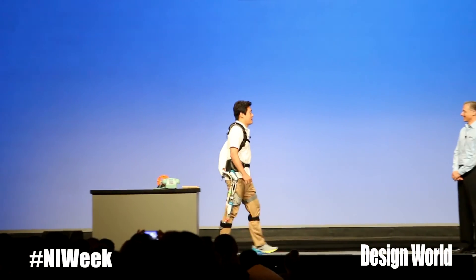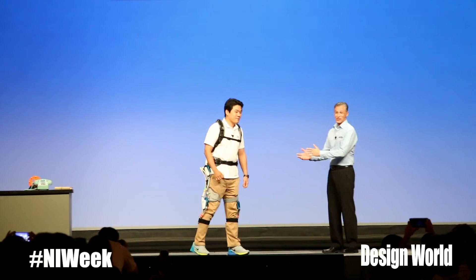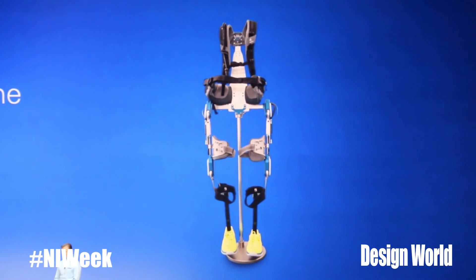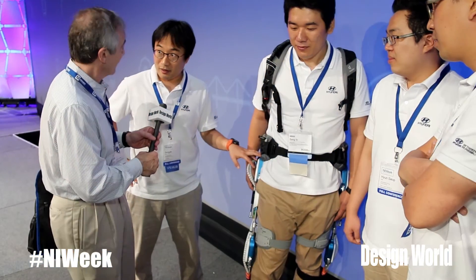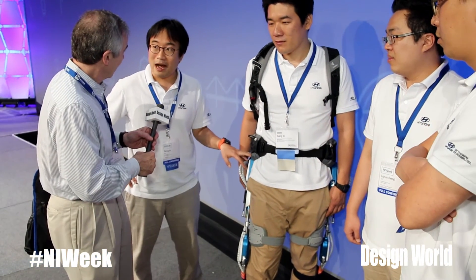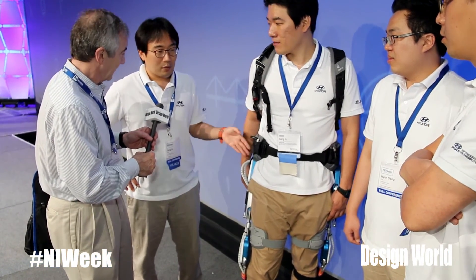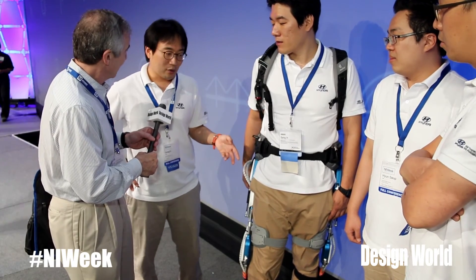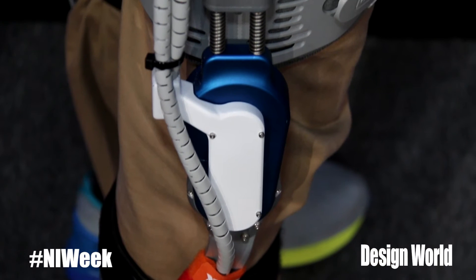So did you develop the drive and the motor in-house, or was any of it purchased? Right now we just use a commercial motor, but we have a plan to make our own motor. We've worked with a lot of universities in Korea, so we will have our unique motor soon.